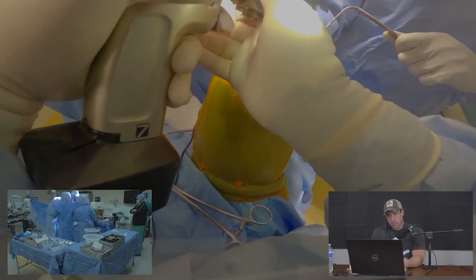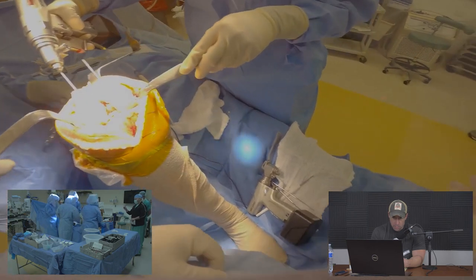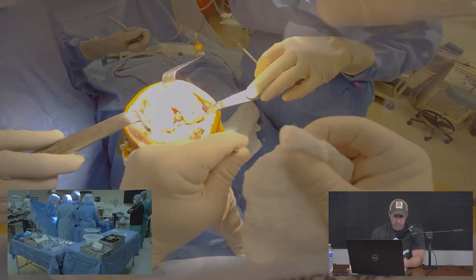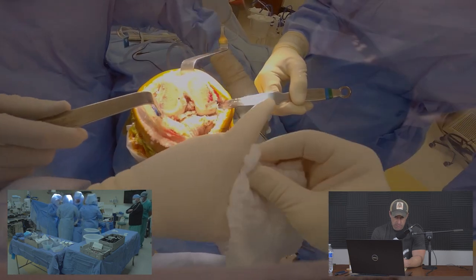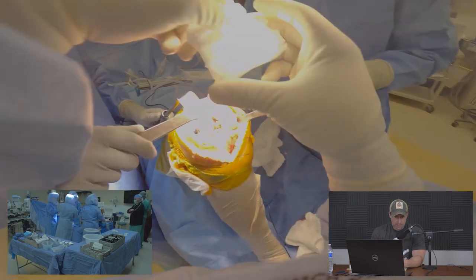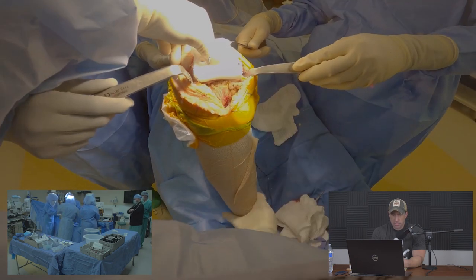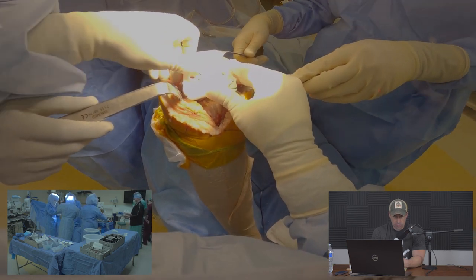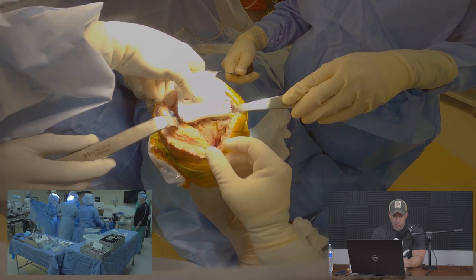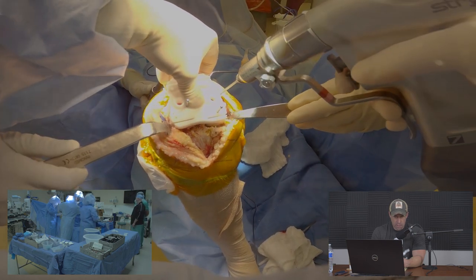The guide is removed and I carefully check that we've made a smooth cut. My assistant removes the pins; I identify the two previously drilled holes and place two smooth pins by hand into those holes. These allow us to place the F4 block. I check its position against anatomic landmarks — in this system there are about five degrees of rotational freedom and we select what we believe to be appropriate.